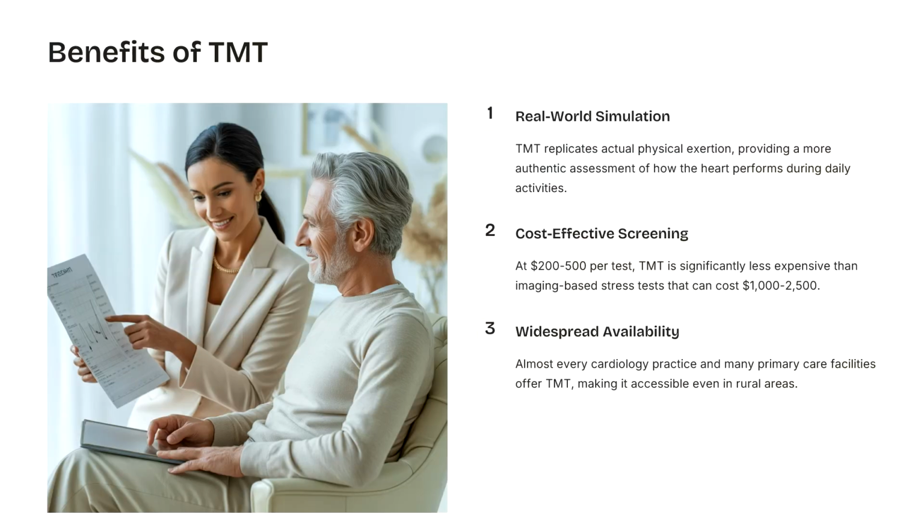What are the benefits of TMT? Why will a person do TMT? Number one, real world simulation, meaning TMT replicates actual physical exertion, providing a more authentic assessment of how the heart performs during daily activities. So if that particular patient can overcome the stress of the TMT, that means in the regular daily world, he or she is fit to do any type of job.